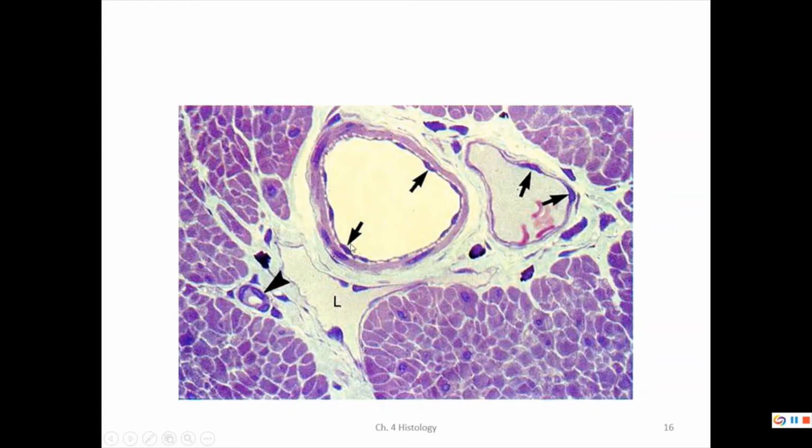Here, artery-like, an arteriole maybe, and here we have a smaller vein. And we're in a muscle, the skeletal muscle of the body. And you can see here that these are my little cells that line the blood vessels, my simple squamous. Each of these arrows are pointing at a simple squamous. So it's only one layer. Now this other stuff here, that's smooth muscle tissue. Here's some connective tissues. Here's skeletal muscle tissue.